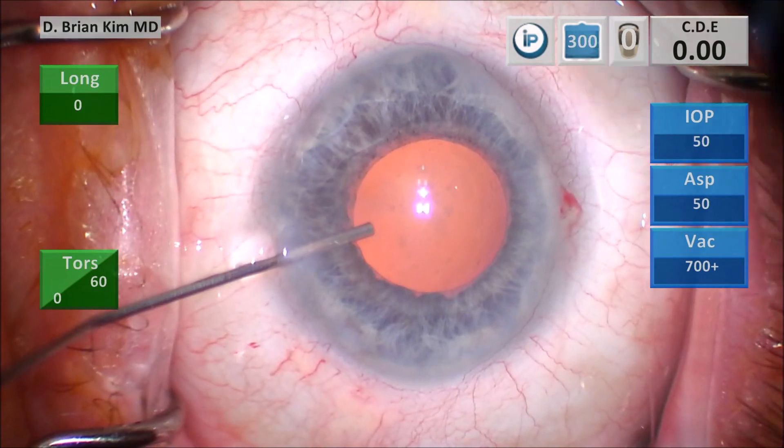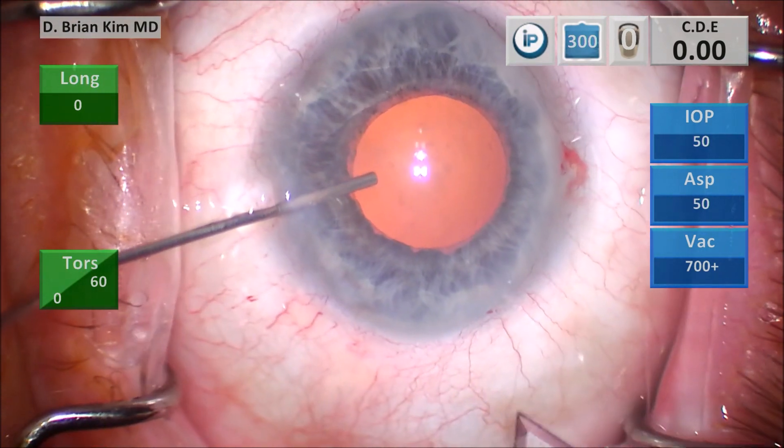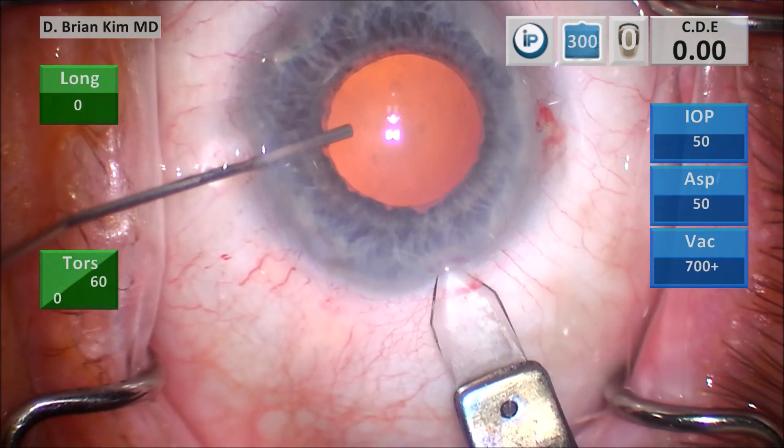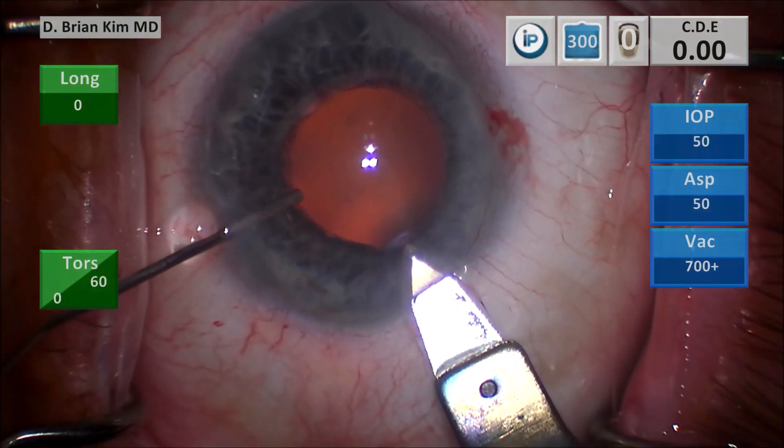I'm doing my triplanar corneal incision. I make a vertical groove, place the blade into the deep part of the groove, tunnel to the cornea, and then enter. I use the cannula to help control the eye for this maneuver.